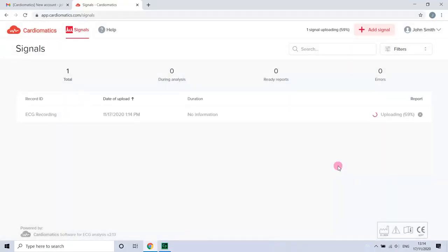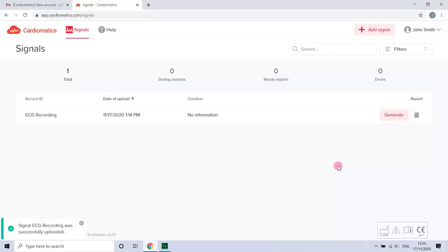Don't disrupt this process until it's finished. When it's uploaded, click button generate to request the analysis.